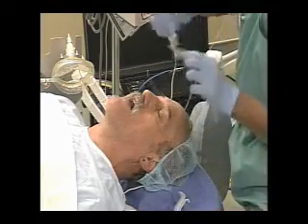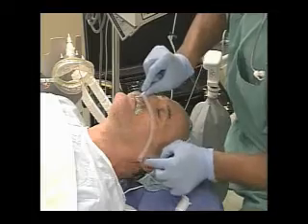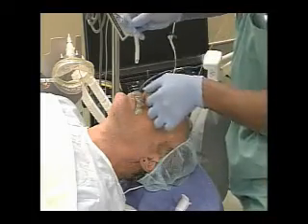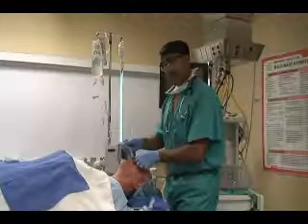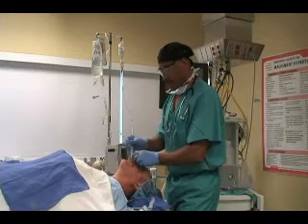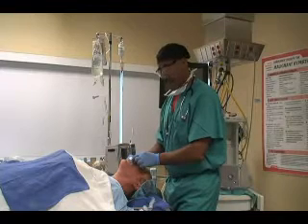If I'm using the nasal airway, I'll have it lubricated, and it's measured like so from the nose to the tip of the ear. I'll lubricate it, pull the nose back a little bit, bevel to the septum, slide it in with a little twist, and it'll go down into place.